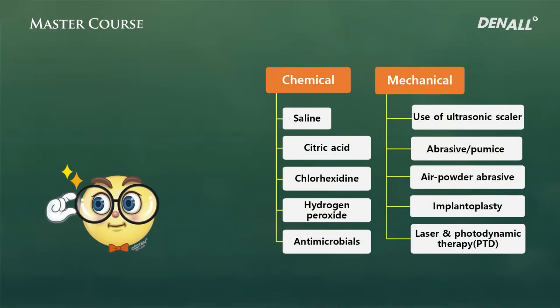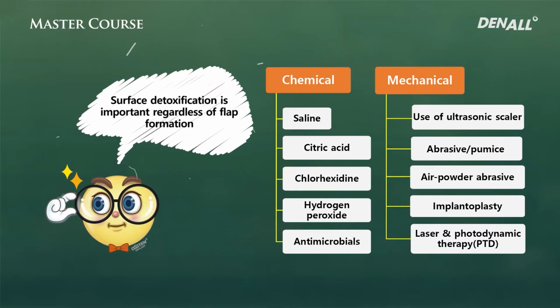I am saying this repeatedly, but the non-surgical treatment method can also be applied to the surgical treatment method as well. How well can this be applied to the contaminated surface? Is there a difference when we open the flap or not? These need to be considered.